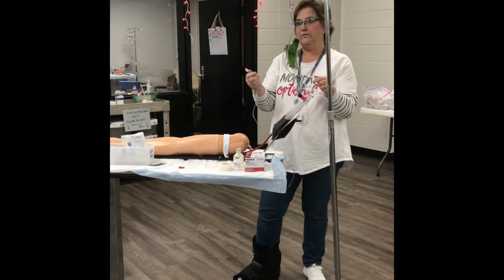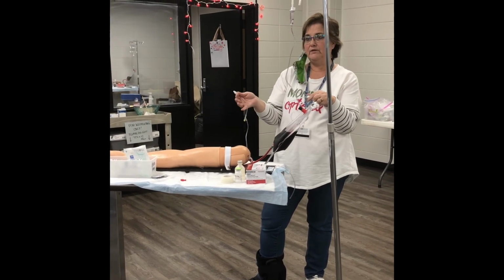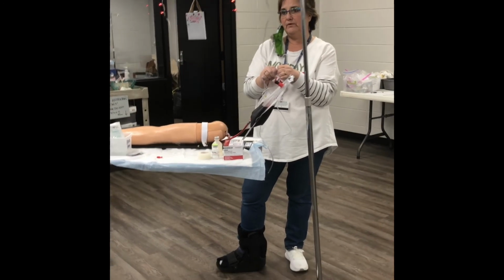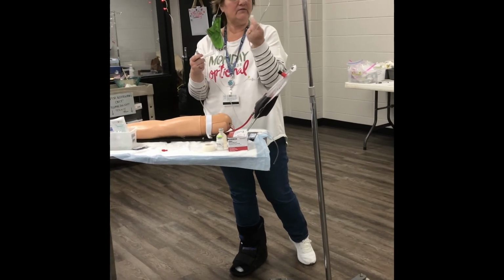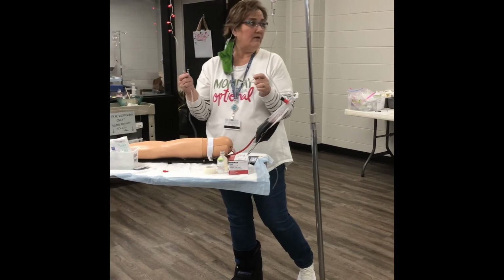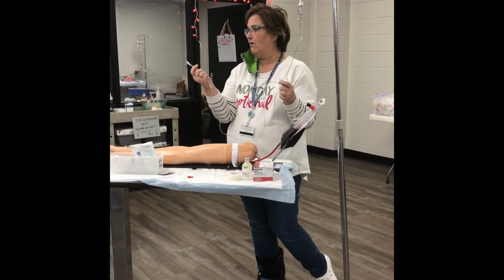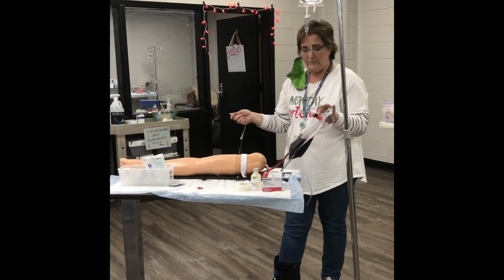So you would open this up, leave the cap on the end. It should prime around it. You should be able to let the fluids go around it. If you can't, you can loosen it up a little bit, but don't take it off, because first of all, you have to make sure this doesn't get contaminated, and second of all, if it does get contaminated, you have to walk around with this in your hand the rest of the time, because you can't put it down, because this will get contaminated. So just leave it on over the garbage.